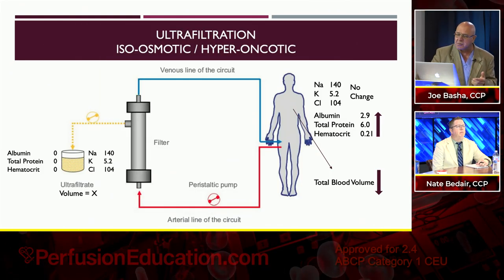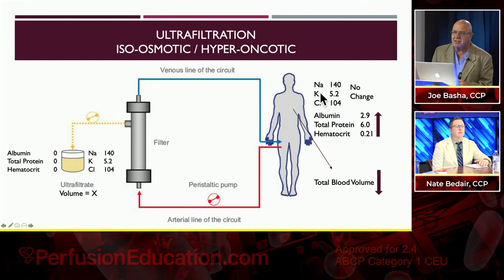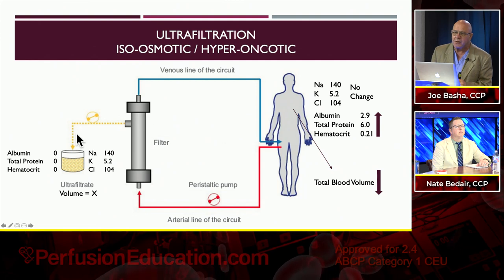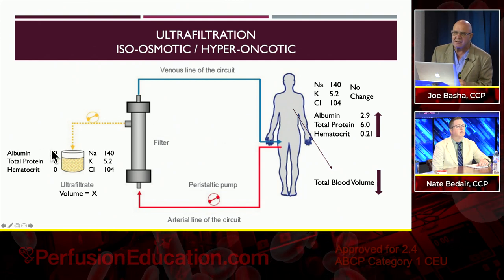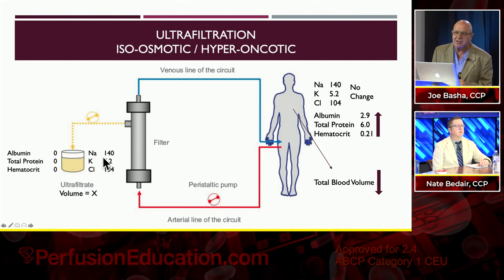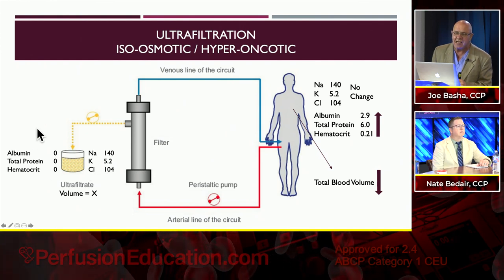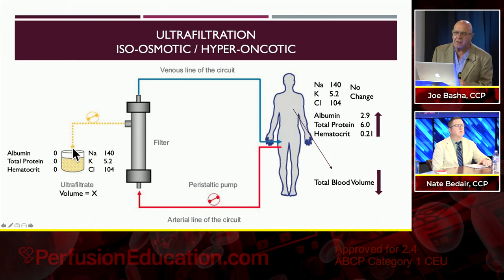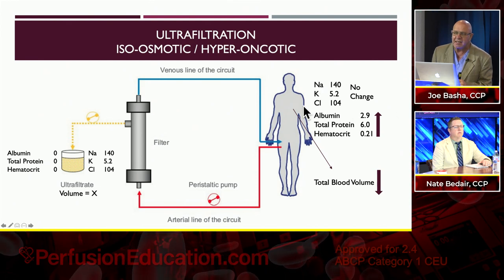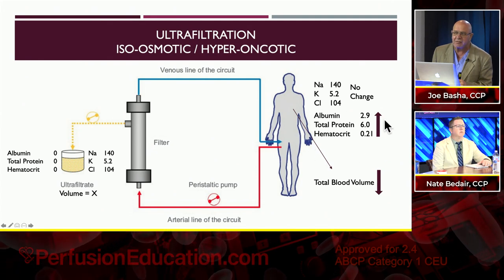We talked about this, and this was very important. If you look over here at our patient, you see the sodium, potassium, chloride is this, and you see albumin, total protein and hematocrit is that. When you look at the ultrafiltrate, you'll see that there is no albumin, protein or red blood cells, but what you do see is the sodium is exactly the same, potassium is the same, chloride is exactly the same. This is referred to as isoosmotic. So if you're pulling fluid off of a patient with a hemoconcentrator, your electrolytes and metabolites will stay exactly the same, but your protein level and hematocrit will come up.